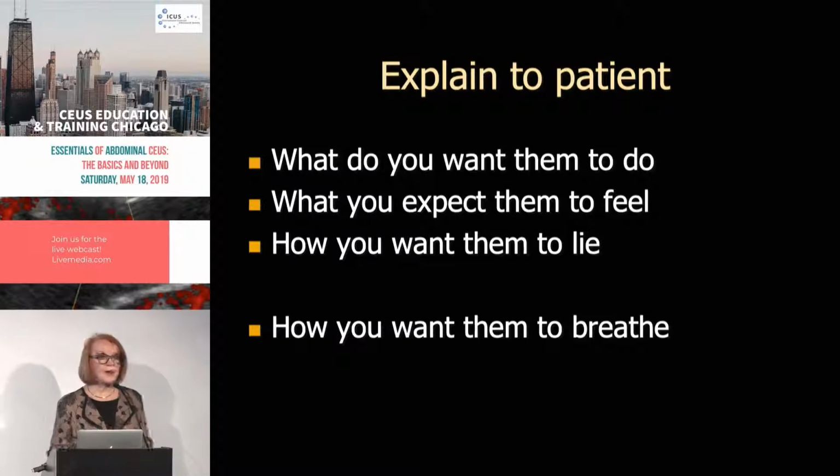You want them to understand how you want them to lie, if they're lying flat on their back, supine, or way up sharply in the lateral decubitus, and you want to tell them how you want them to breathe. And very, very important, if you're in a tertiary institution where they're doing ablations or using ablative procedures on the liver, you want to make sure that all these things that you did to make the scan beautiful for you, to take the nice pictures of the mass, you put into the report.